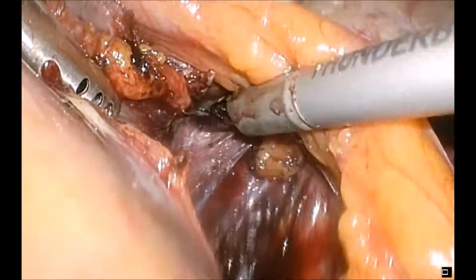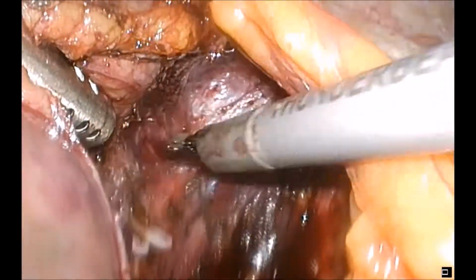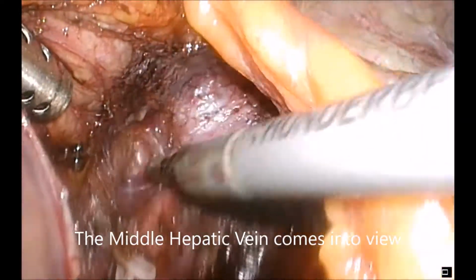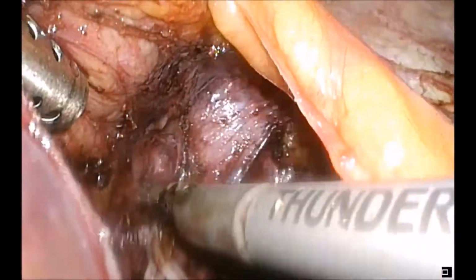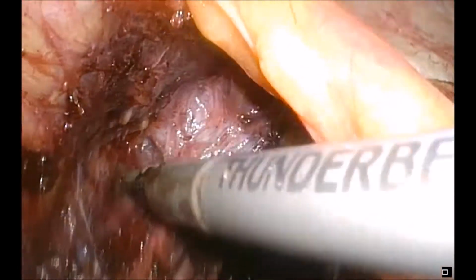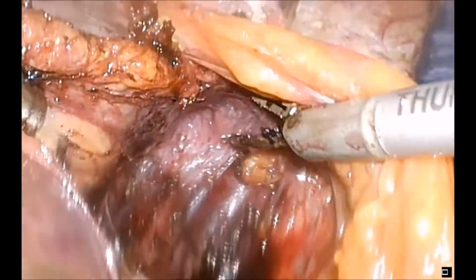Dissection is occurring now in front of the vena cava and behind the left hepatic vein, and ultimately the middle hepatic vein, which the left joins as a common trunk just before it inserts into the inferior vena cava. We can get the impression of that here and see the edge of that common trunk inserting into the cava there.